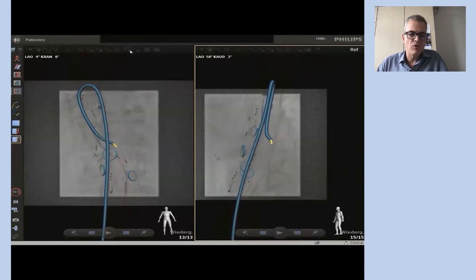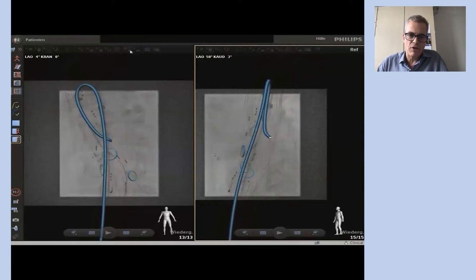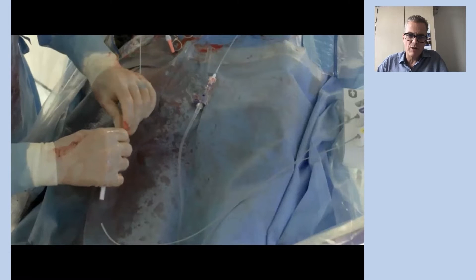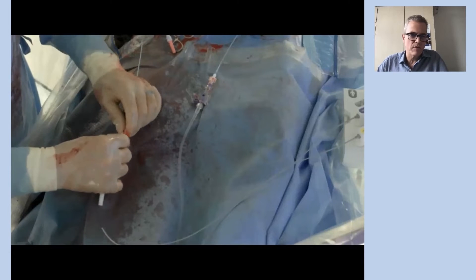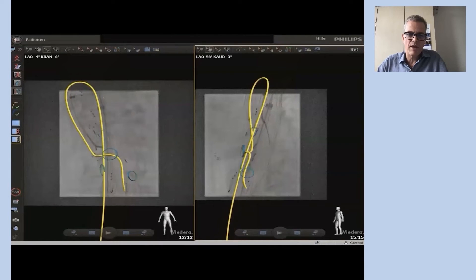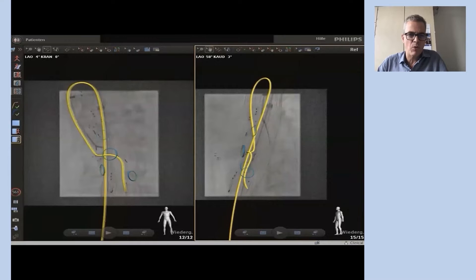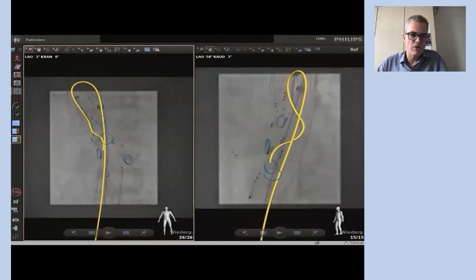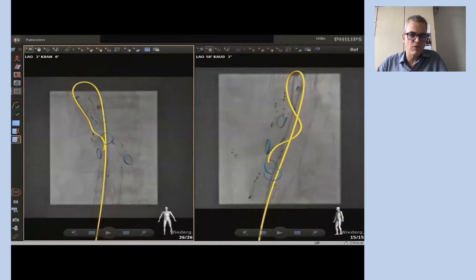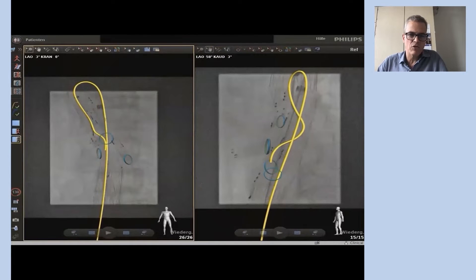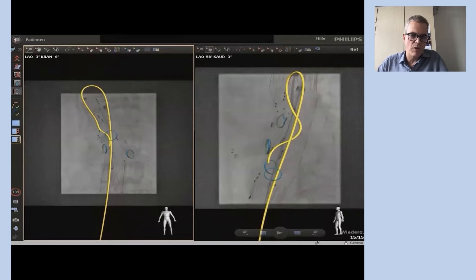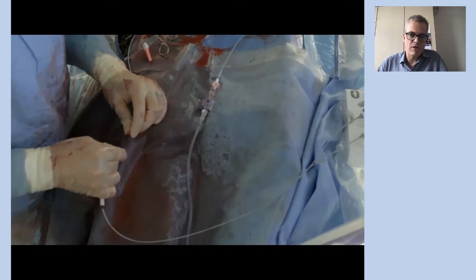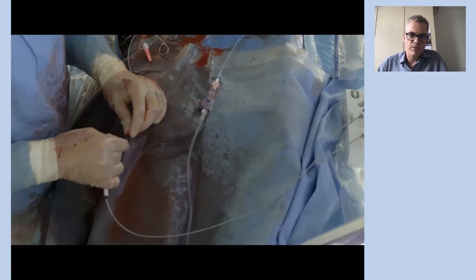Again we use both catheter and wire to catheterize the left renal, but we notice that the catheter does not actually have the required shape. So here you can see that we can use the FORCE wire also with a standard catheter of choice.